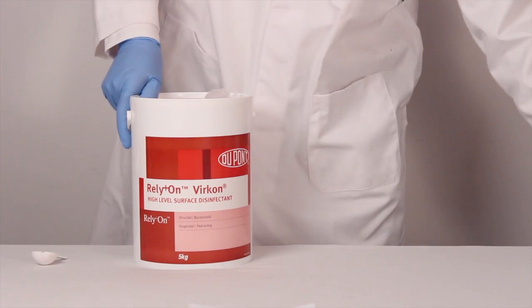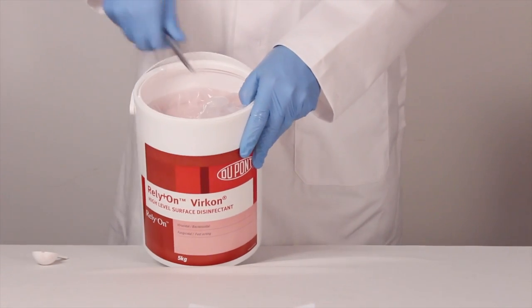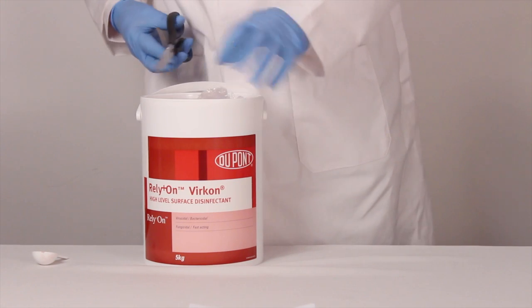The Virkon product is bagged to help prevent any moisture, so carefully cut the seal of the bag using a pair of scissors.